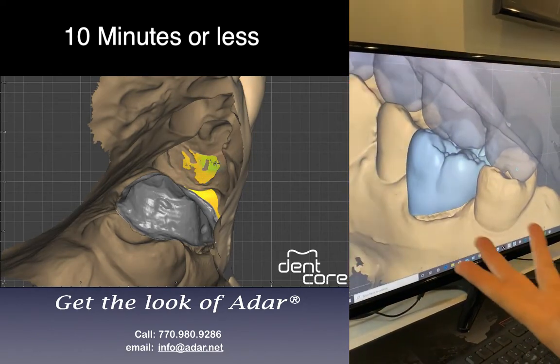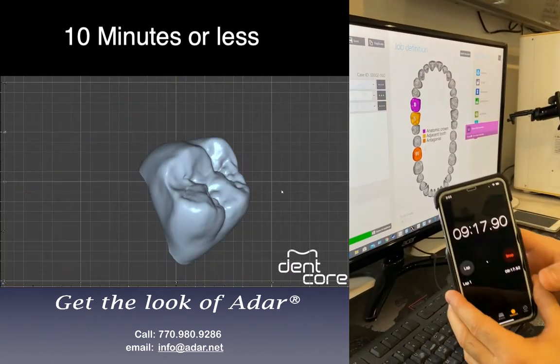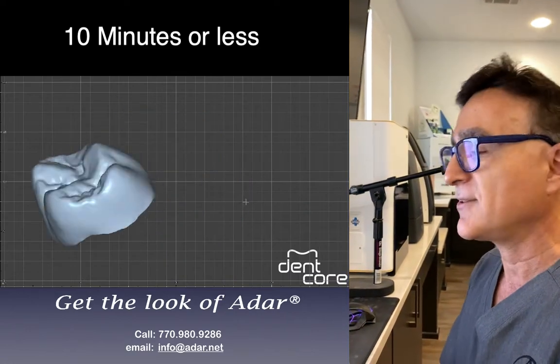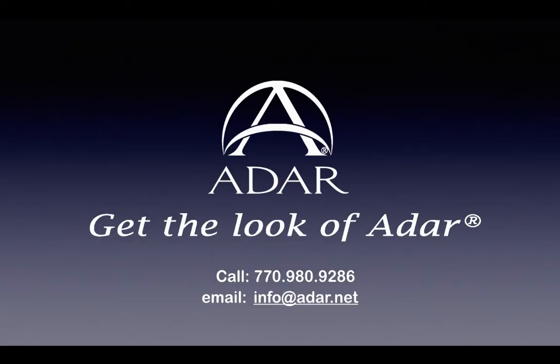Done. So I'll go next — now it's making the wax-up, and it's done. How long did it take? Nine minutes, 17 seconds. I got it faster — that's it. One crown, less than 10 minutes.